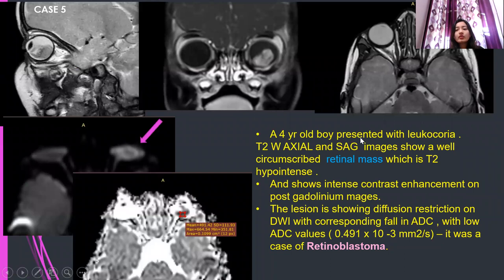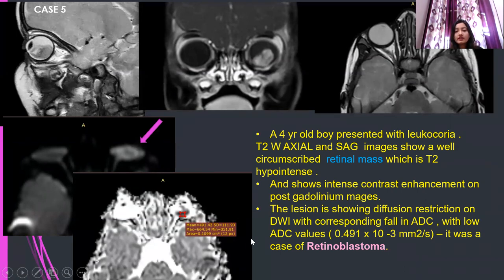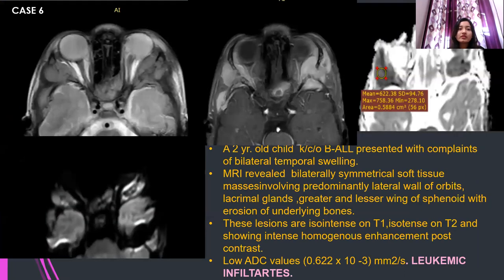Case 5: a 4-year-old boy presented with leukocoria. T2-weighted axial and sagittal images showed a circumscribed retinal mass, which is hypointense on T2, showing intense contrast enhancement and diffusion restriction with a corresponding fall in ADC. The mean ADC value was 0.491 × 10⁻³ mm²/s. It was a case of retinoblastoma.